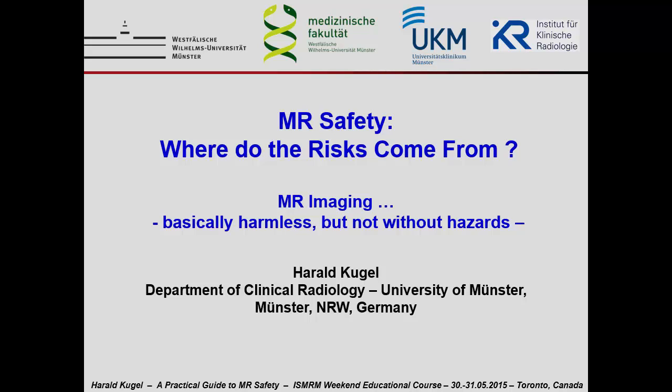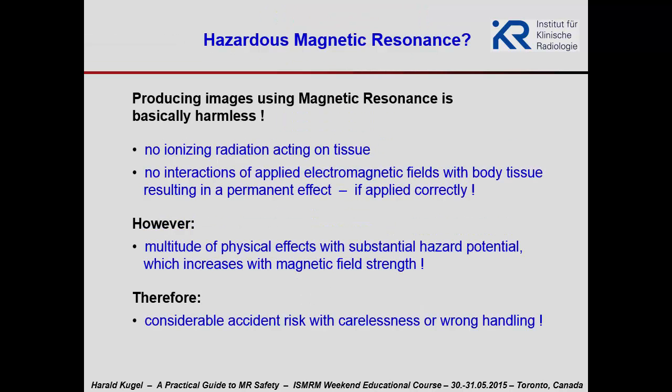The main topic of this session is MR safety. And the first question was, well, where do the risks come from? And the answer is quite easy, it's all physics. MR imaging is basically harmless, but it's not without hazards.